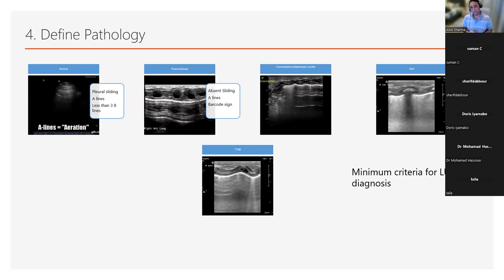The reason I am talking about this is because some of you might not want to use lung ultrasound scores to treat RDS. Some of you might agree that you still want to use a clinical and an FiO2 cutoff for babies between 22 and 32 weeks, and lung ultrasound scores are not part of your guideline. If they are part of your guideline, exactly when are you going to do them, at what age? That's really important, because if you're doing a lung ultrasound at 2 hours of age and another person's doing it at 4 hours of age, then you're not having consistency in your approach to management of different babies, and different babies will get managed in different ways.